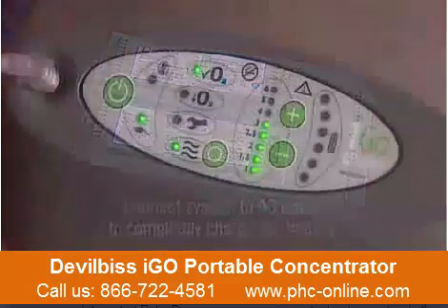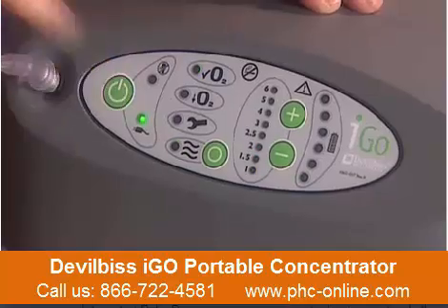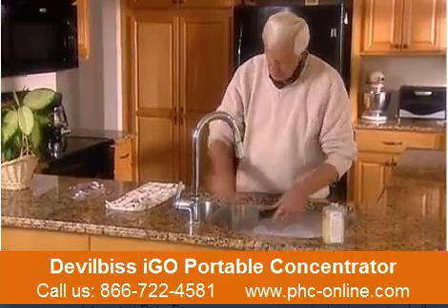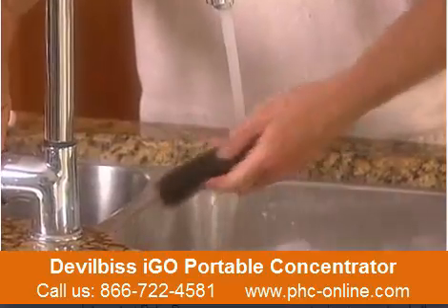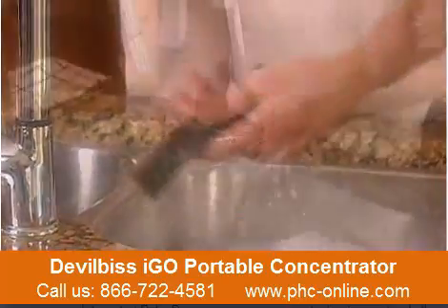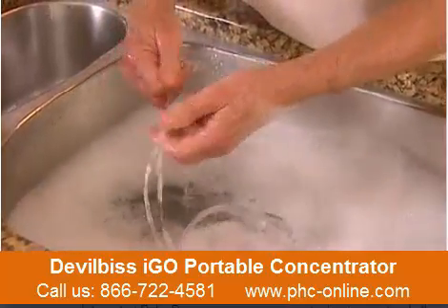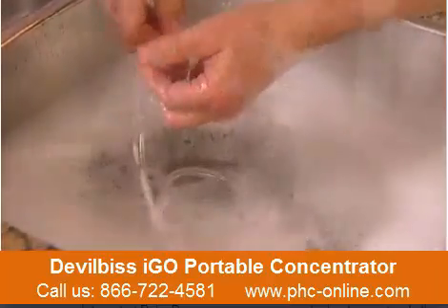To clean and maintain your iGo portable oxygen system, turn the unit off. The air filter should be removed and cleaned weekly in a solution of warm water and dishwashing detergent. Rinse thoroughly in warm water and towel dry. The filter should be completely dry before it's reinstalled. Cannula, tubing, and humidification accessories should be cleaned and replaced as instructed by your Devilbiss provider. Consult your instruction guide for additional information.